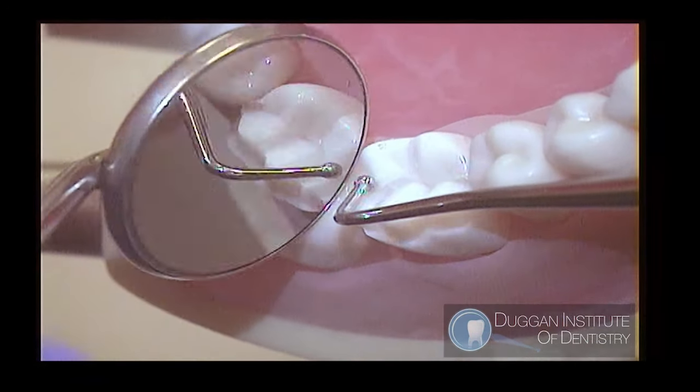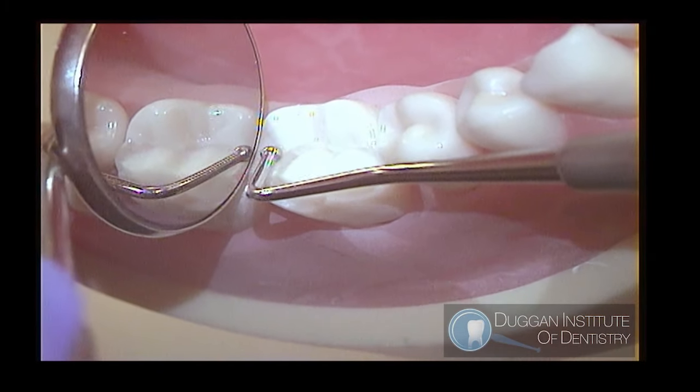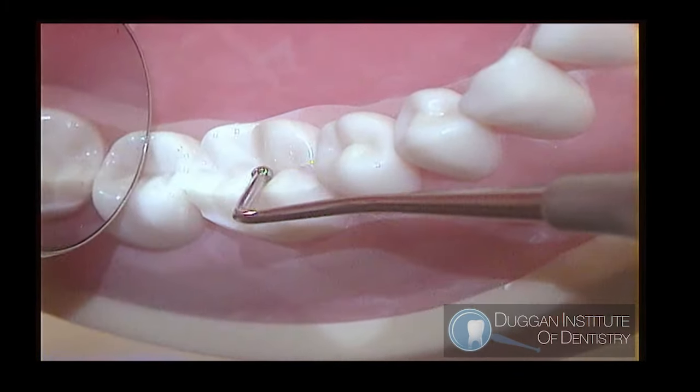Here you can see I'm using a 1mm ball burnisher to measure the reduction at the central groove.